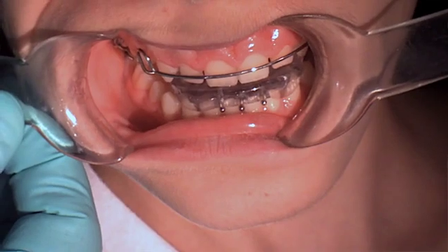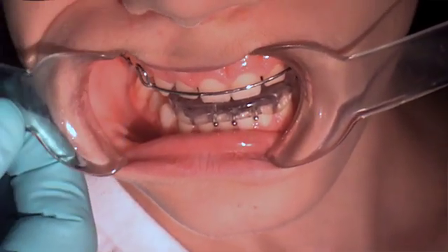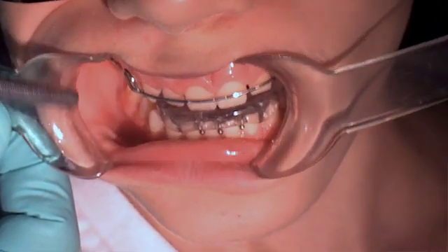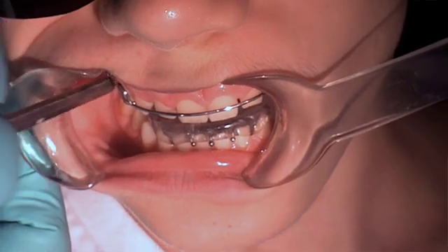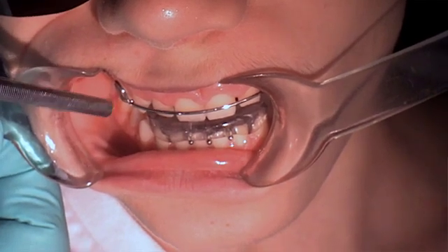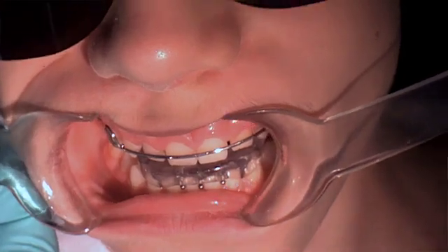When I take the appliance out you'll see the retention elements better. You have a delta clasp and a ball clasp, making it very retentive. In the lower, just on the terminal molar, we have a C-clasp — much like the twin block design — for retention of the lower.